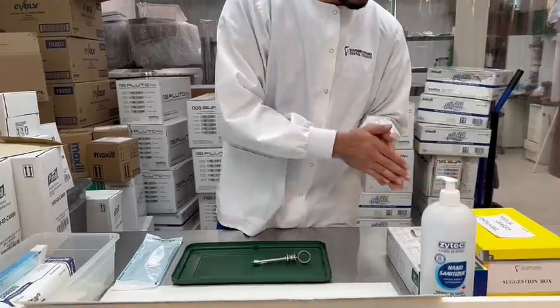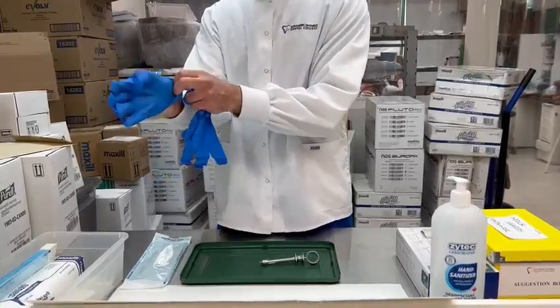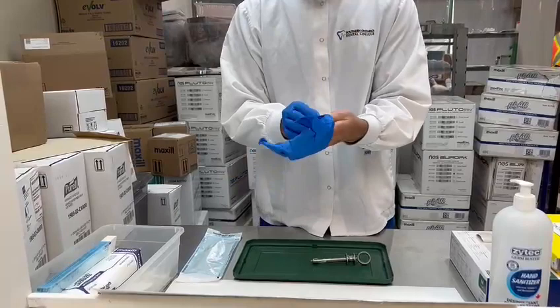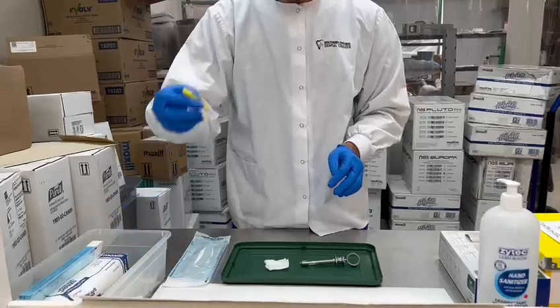We sanitize again and grab a pair of gloves. After getting the gloves, we grab a piece of gauze to test the syringe on and we grab a needle.